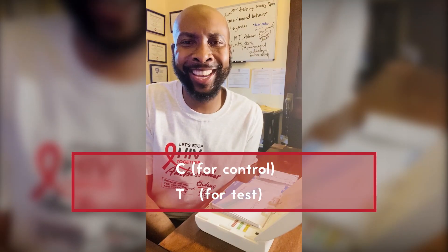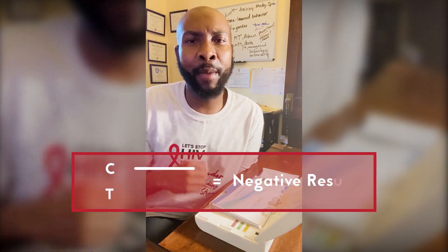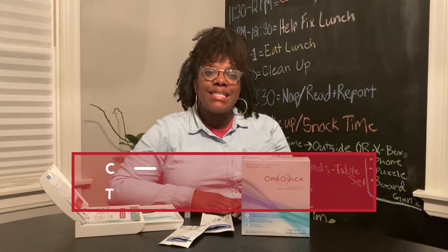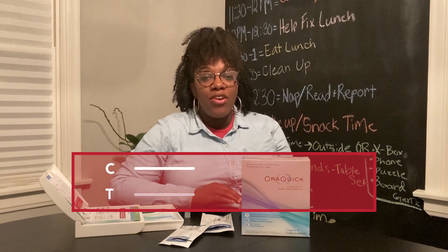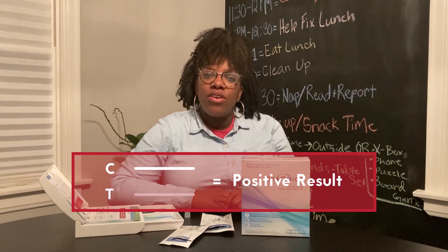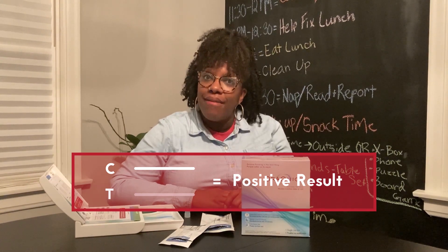So it has been 20 minutes and I took my test, and now it's time to check my results. There are two letters on the test stick: a C and a T. If you have one line by the C, that means your test is negative. If there's a line next to the C and any line next to the T — even if it's very faint — your test result is positive and you may have HIV.